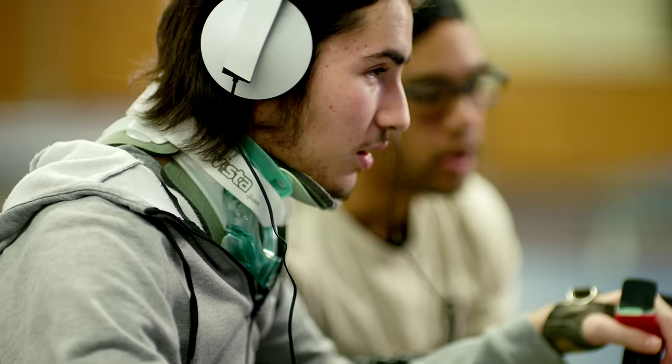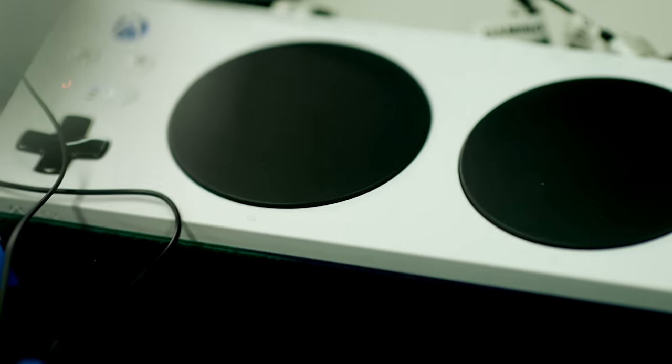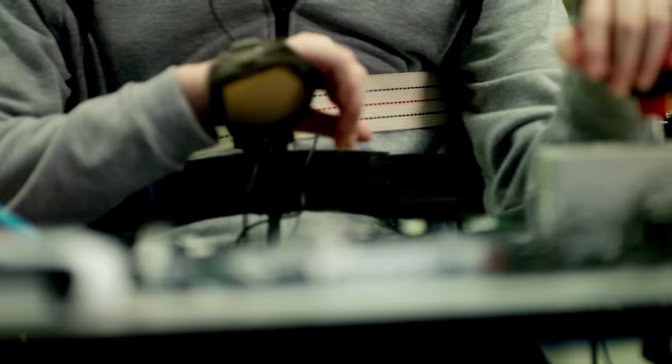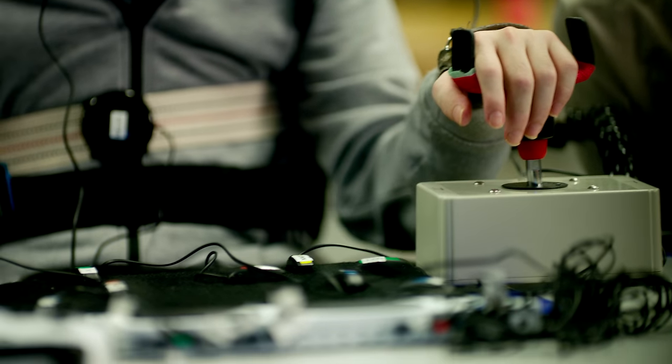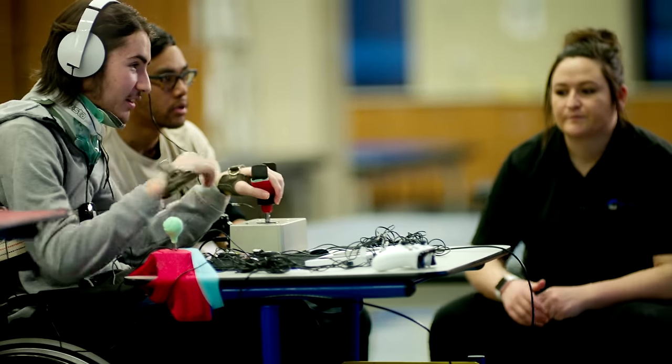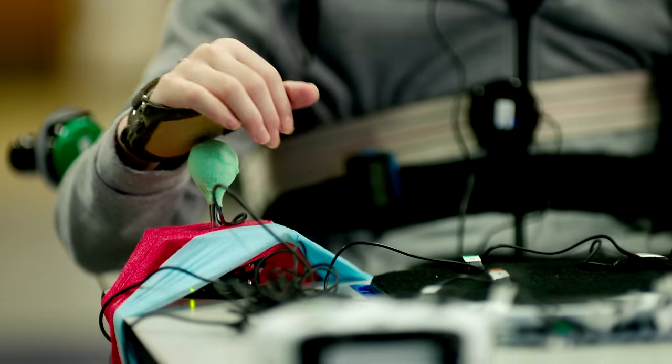Our role as occupational therapists is to get people back to doing. When the Xbox Adaptive Controller came along, it acted like an Xbox controller, and it just worked. On the standard Xbox controller, it's just hard to press the buttons because I can't really put pressure through my hands, but with the Adaptive Controller, I can use larger joysticks, larger buttons that are easier to press and reach.